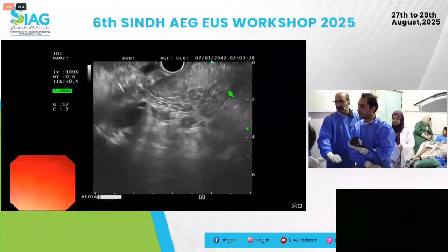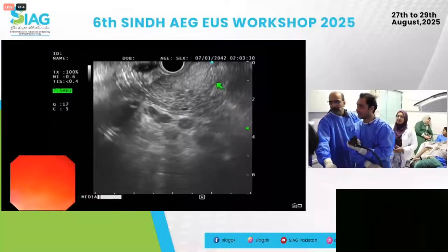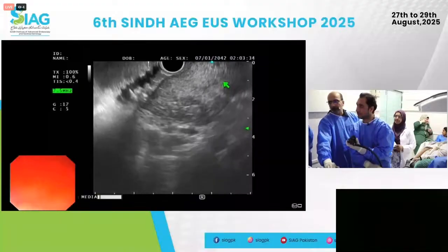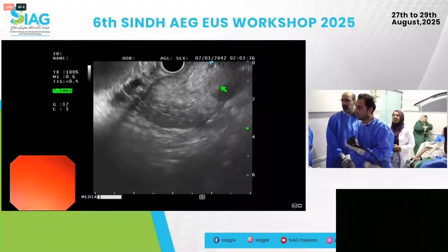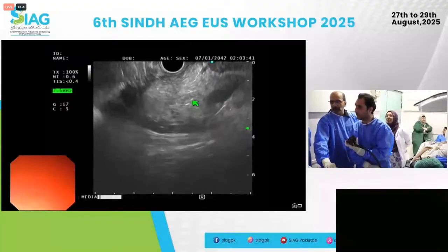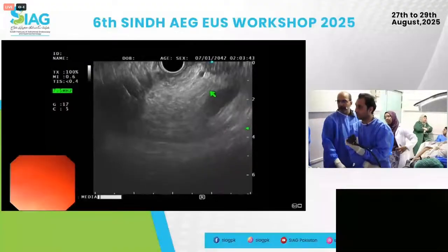And there's the pancreatic duct. Yep, right there. And now we're compressing it, but it does get compressed here on the pullback. But keep pulling back. That's your portal vein below, so relax your big wheel so you can see the duct. We're just compressing it a bit.